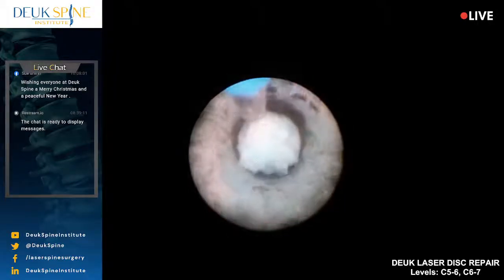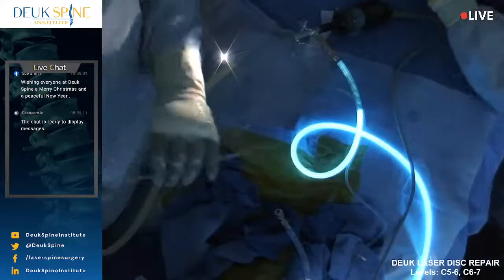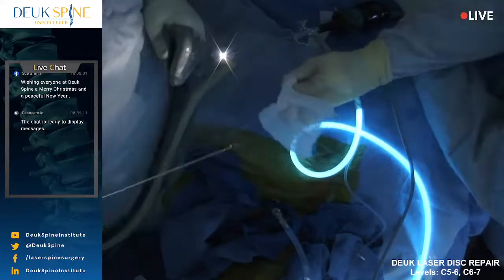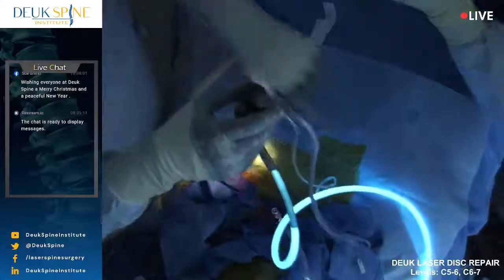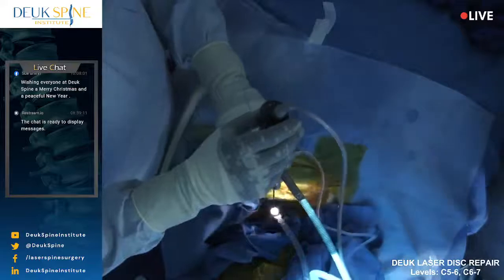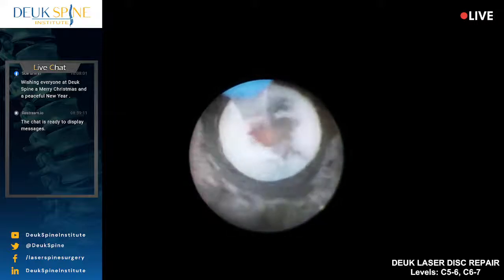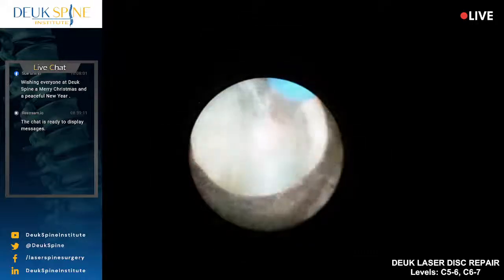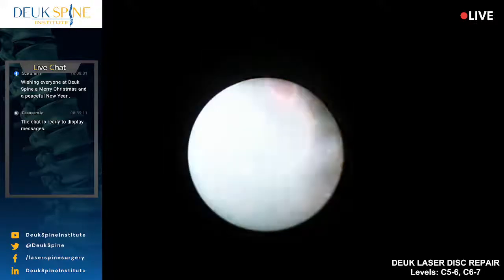Woo-wee. That's a piece of herniation right there. All right, this is C6-7, and things are going well for this patient. We've had 0 blood loss. I think we had half a drop of blood. It takes 20 drops of blood to make a milliliter. We've had half a drop, so we would literally call this surgery a no blood loss. If you get less than a milliliter of blood loss in a surgery, then it's no blood loss, really. So that's what we get typically with our surgeries. We get pretty much no blood loss with the laser endoscopic surgery.